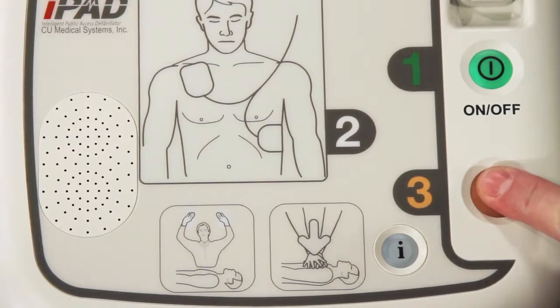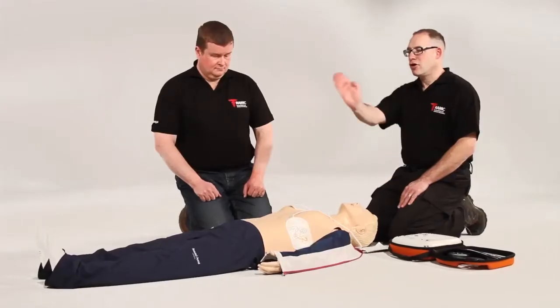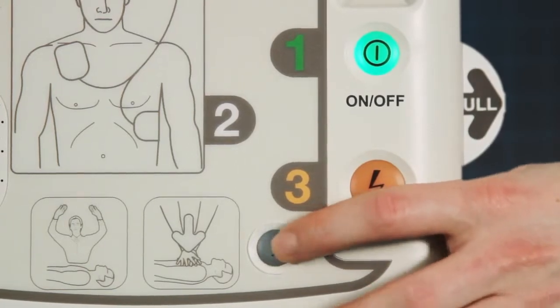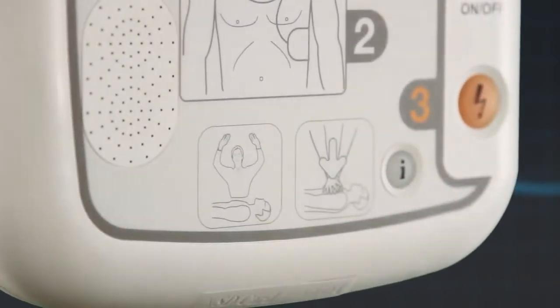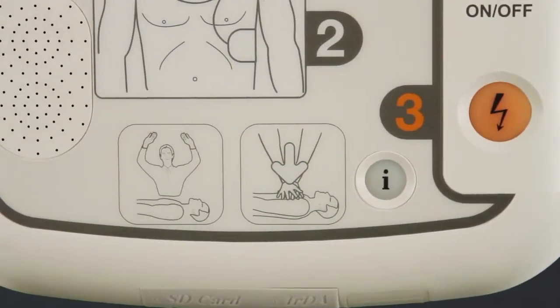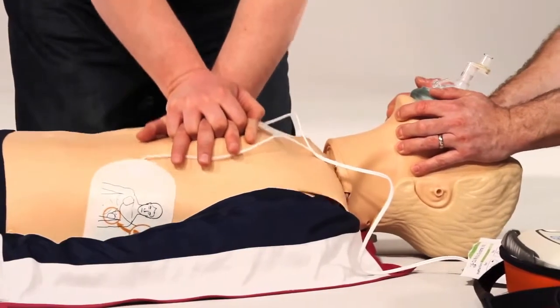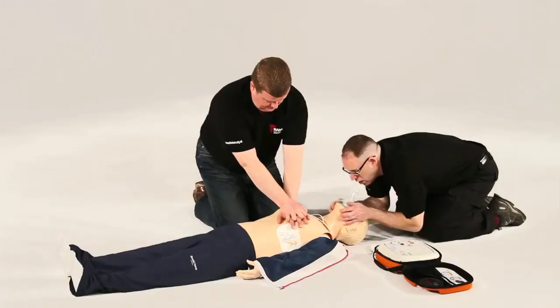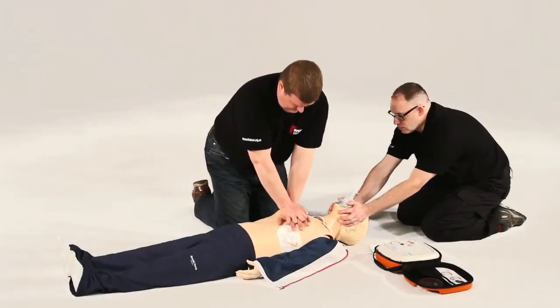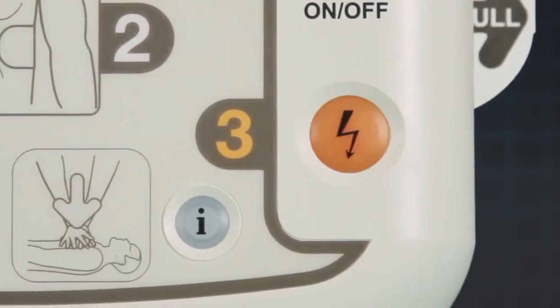Press the flashing orange button now. The iPad SP1 AED will then prompt you to commence CPR. Begin CPR now. If you press the flashing blue I button, the AED will commence with CPR voice prompts. This includes a metronome for compression rate and a verbal command for when to breathe for the patient. If you choose not to press the flashing blue I button, the iPad SP1 will verbally tell you how long until it reanalyses, repeated at regular intervals.